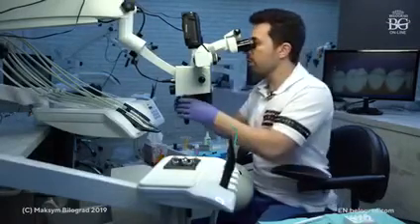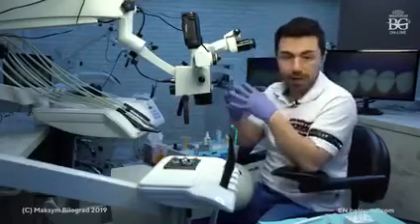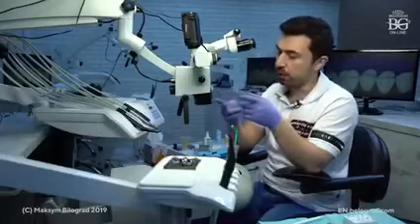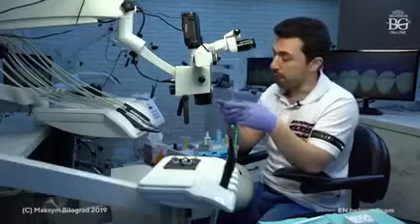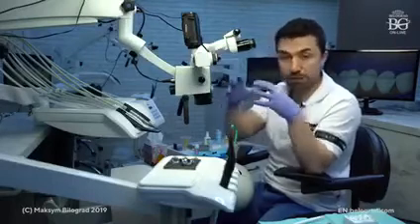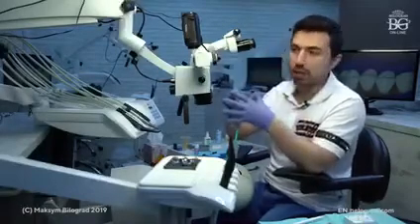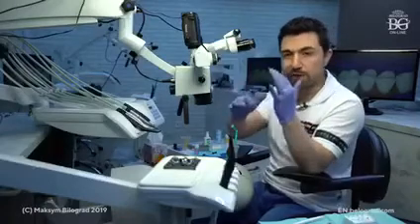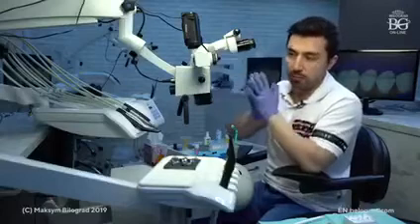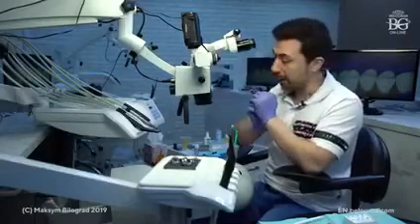And for sure, when you cover all the occlusal surface, these are the cases when you do a full molar rehab case. For example, you have attrition, erosion, tooth wear, parafunction, you need to raise the bite, you need to raise the VDO, you need to do something in the occlusal area, and also you need to change the color because of aesthetics. So basically this is veneer overlay preparation. It's not the classic veneer, it's the veneer overlay preparation, and we can utilize this type of prep in certain clinical cases.